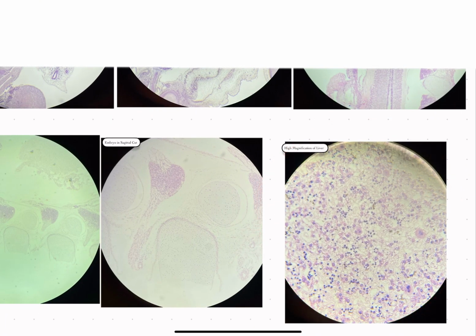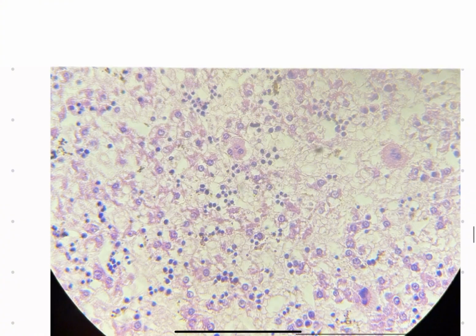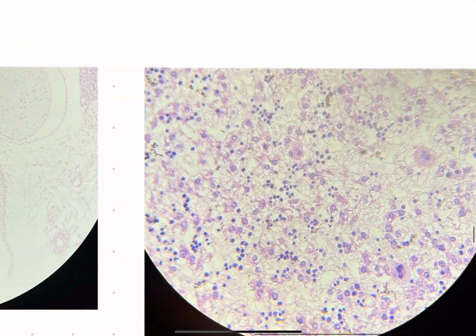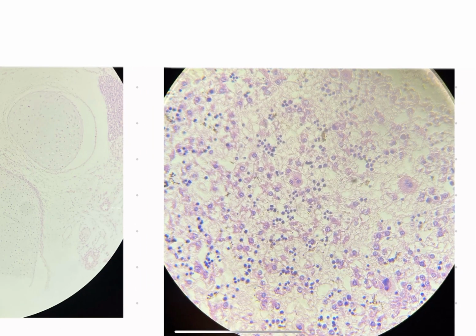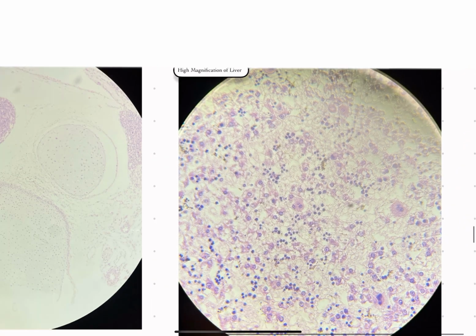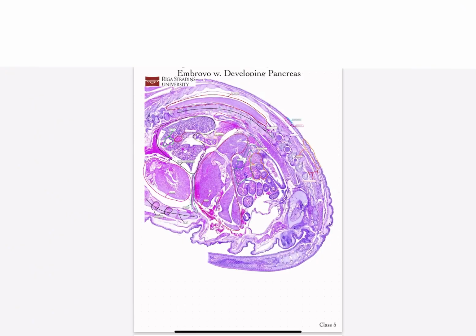This is a liver in high magnification, and it's very fragmented, so we can barely distinguish the hepatocytes like so, and these would be the hematopoietic islands. And then we have the megakaryocytes, which would be this. So we have 3 nuclei here, apparently. This would be another megakaryocyte. Like I said, they appear very large and pink. So if you see a large and pink and multinucleated cell that looks like it's just a clump of other cells, you're within the liver, and it's most likely a megakaryocyte. This would be another one, I believe.